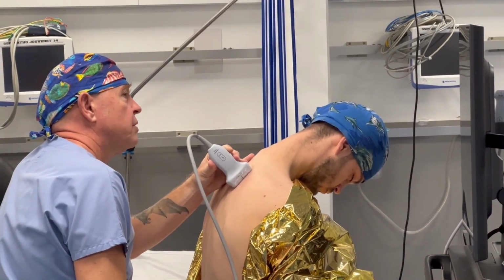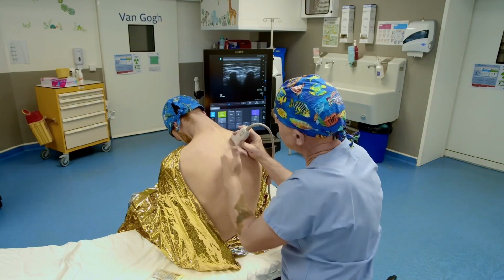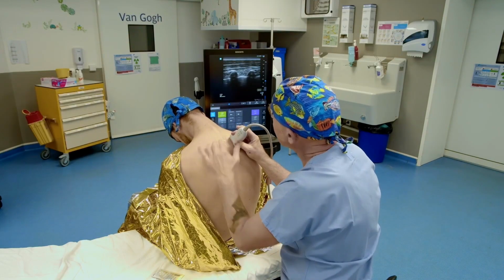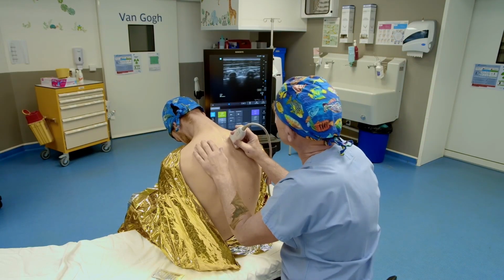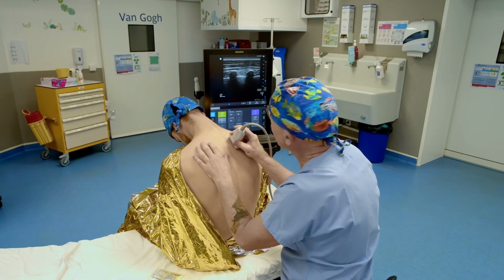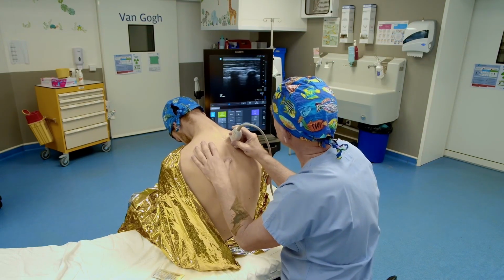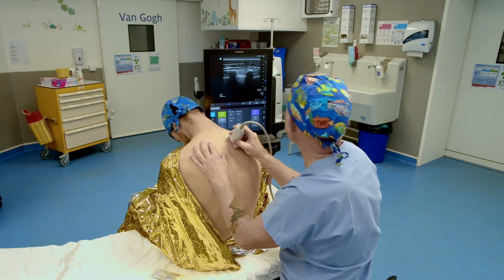And here you have roughly the visualization. Again, this raises questions about the level of punctures, the number of punctures, single or double punctures, unilateral or bilateral punctures. It depends a bit on your surgery, but here I refer you to all the more comprehensive manuals or websites that discuss this. They explain it much better than I do. There you go, we finished with this workshop.